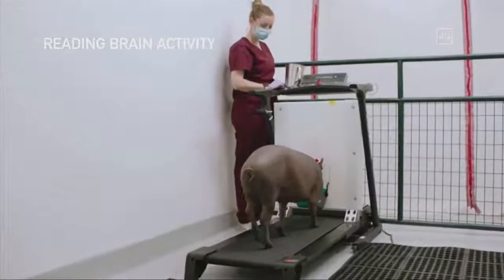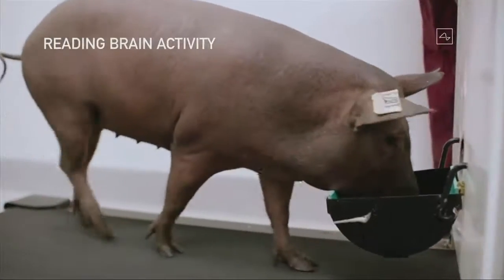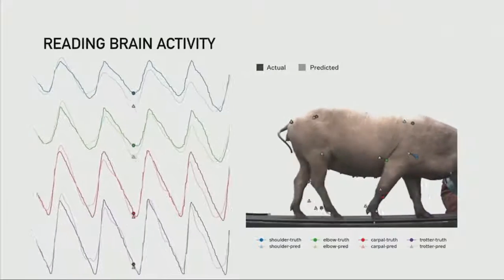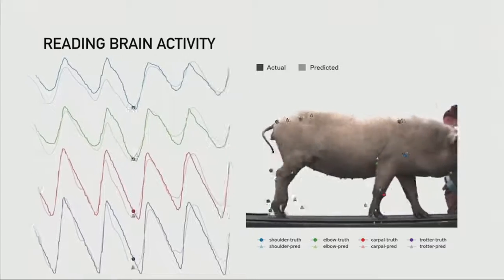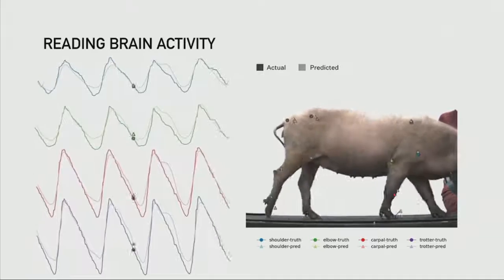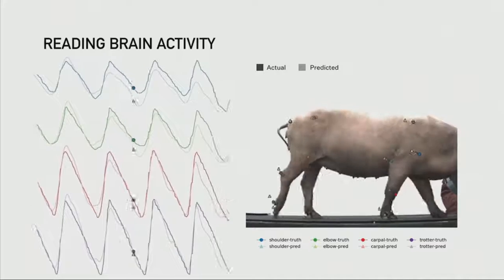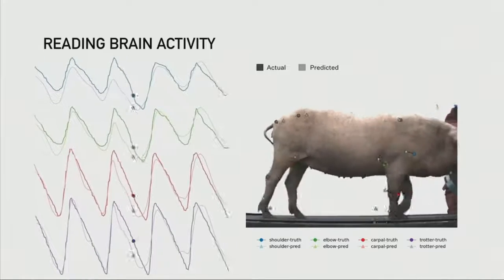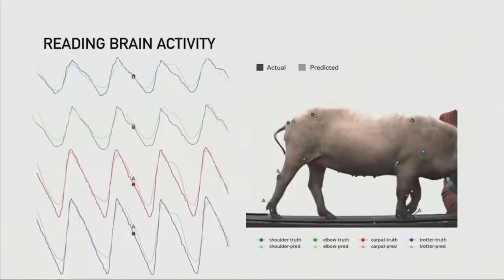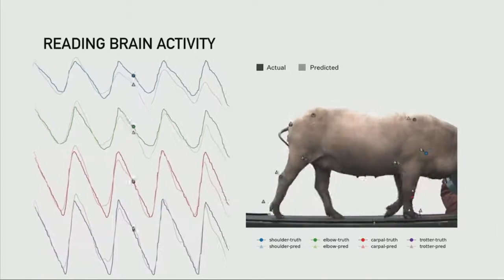So in terms of additional brain reading activity, when we have, say, one of our pigs on a treadmill, pig on a treadmill. It's a funny concept, really. And we take the readings from the neurons, and we try to predict the position of the joints. And so we say we have the predicted position of the joints, and then we measure the actual position of the joints. You can see that they're almost exactly aligned. So we're able, with a wireless neural implant, to actually predict the position of all of the limbs in the pig's body with very high accuracy.